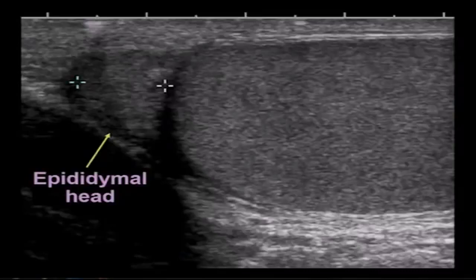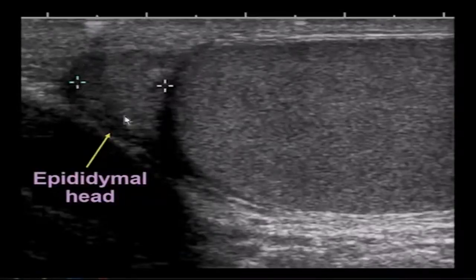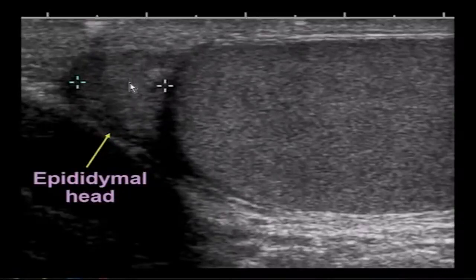We also look for the epididymis when we evaluate the testicles and the scrotum. The epididymal head sits at the superior aspect of the testicle, and its echogenicity is similar to the testicular parenchyma itself.